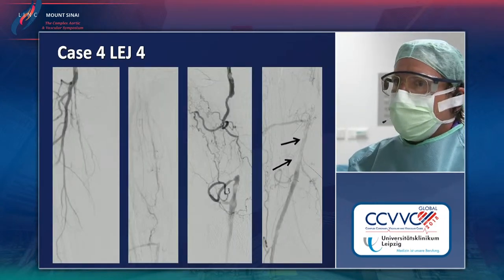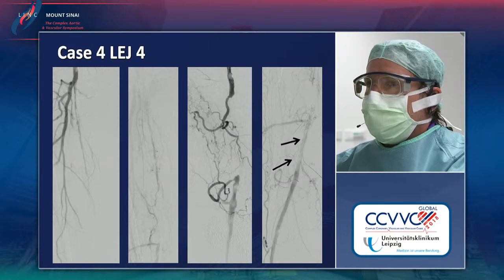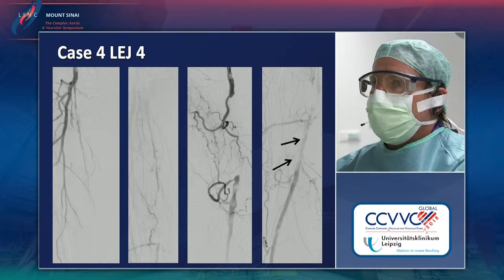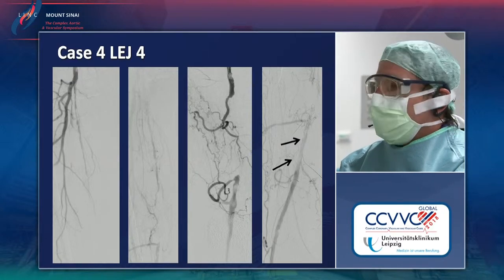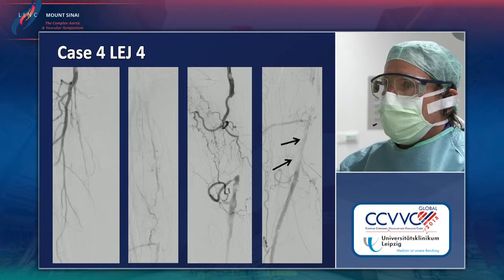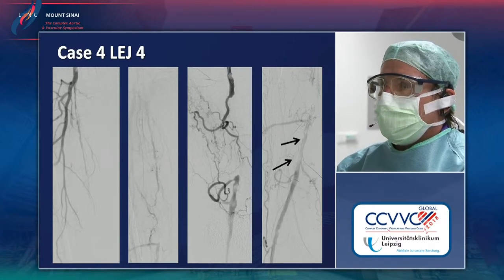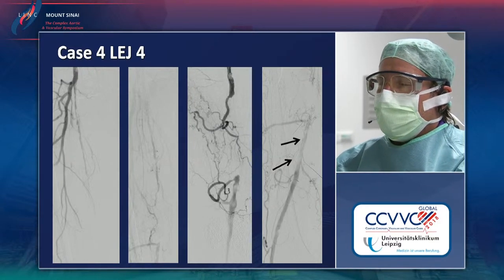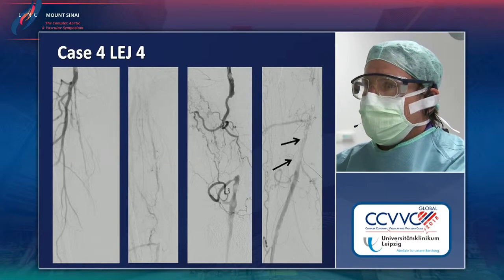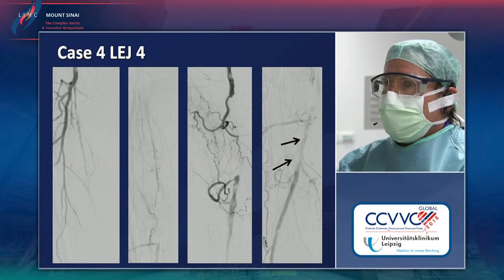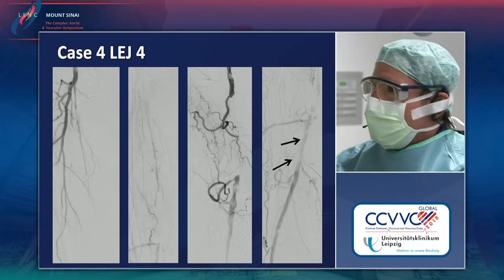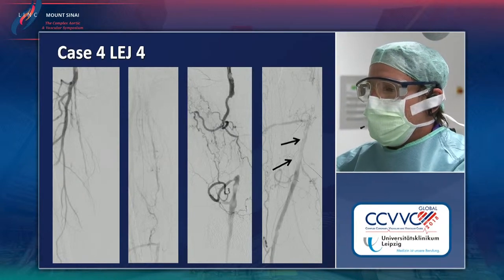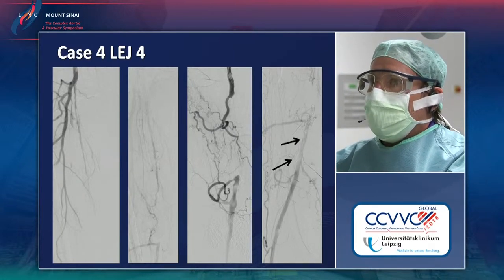This is the angiography. You can see the proximal portion of the SFA on the right side is still patent but severely diseased. Then there is occlusion — a quite calcified occlusion. Elsewhere there was already an attempt to recanalize this occlusion, also with a retrograde puncture of the distal SFA, indicated here by the arrows. However, that attempt was not successful and now we hope we can recanalize this occlusion. This patient is really symptomatic and truly requires treatment.